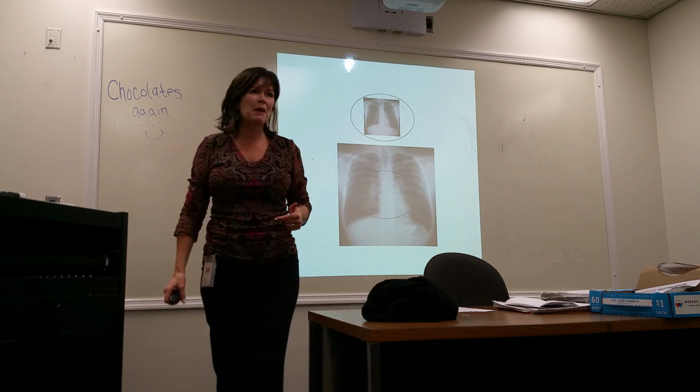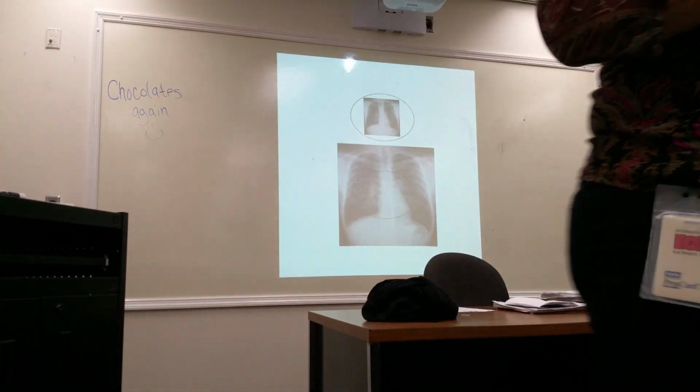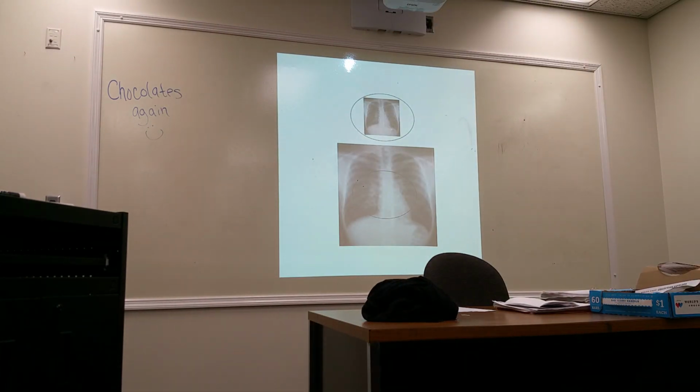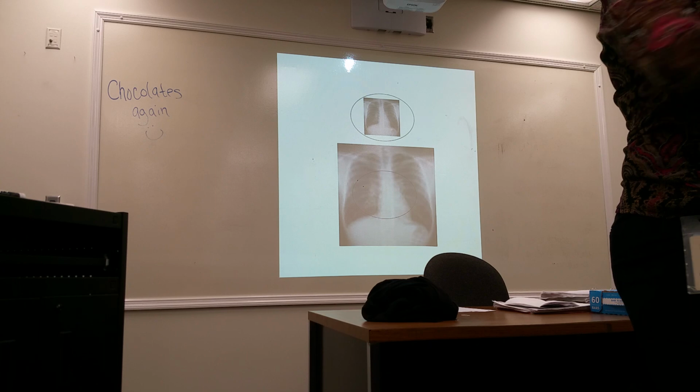So what happens to patient exposure? Goes up. It increases. So anytime the doctor goes into mag mode, the patient exposure is increasing. If you're in the room with them, then the scatter reaching you increases also. So the doctors try to, or should try to, minimize their time in the mag mode.